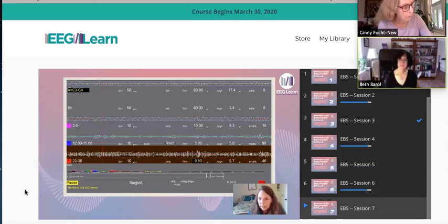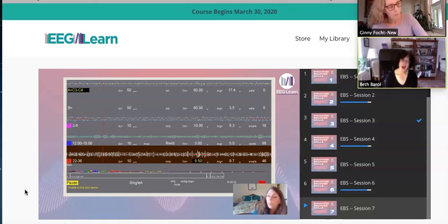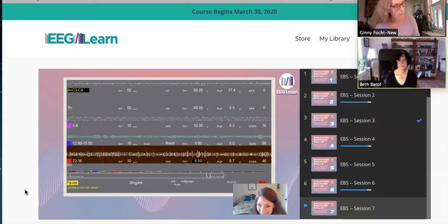It can adjust something about the timing on the left versus the right in these frequency ranges. And just looking at the numbers on our screen, we can't really tell which strategy the person's brain is using. But as long as the numbers are kind of trending in the direction we want them to go, we can guess that their brain is picking the strategy it likes, and it's getting the message about what we're asking it to do.